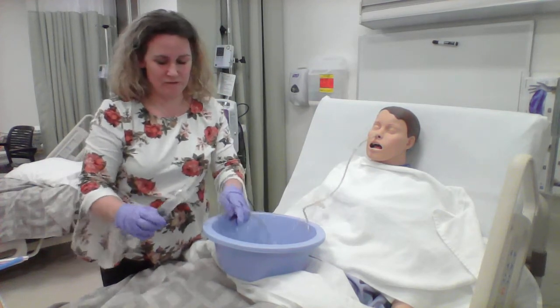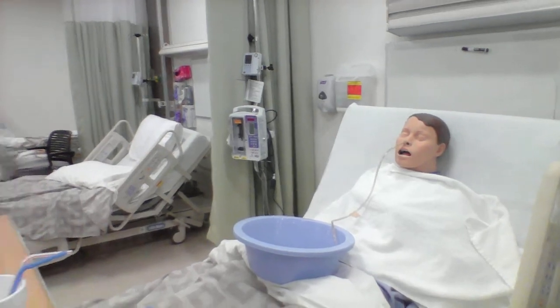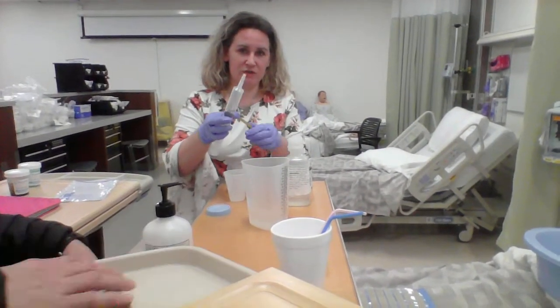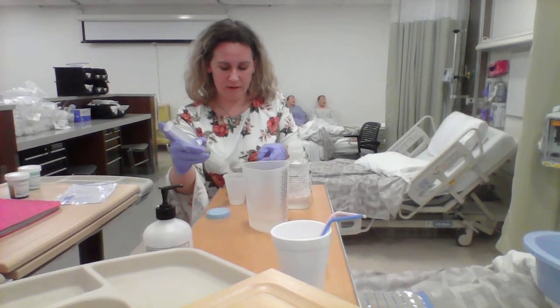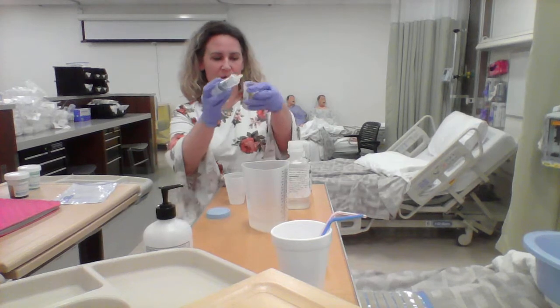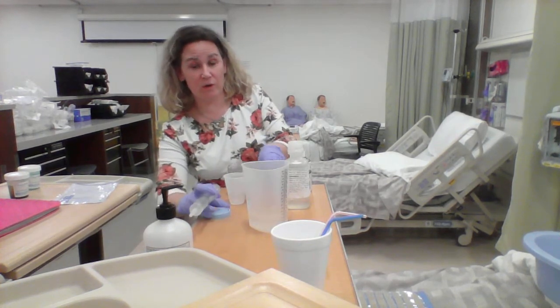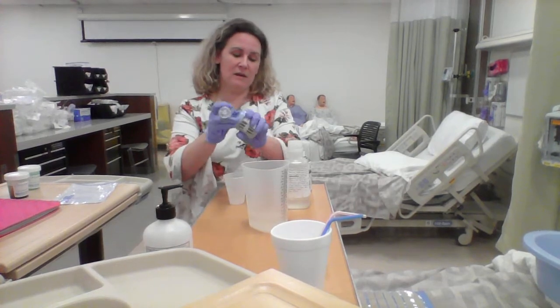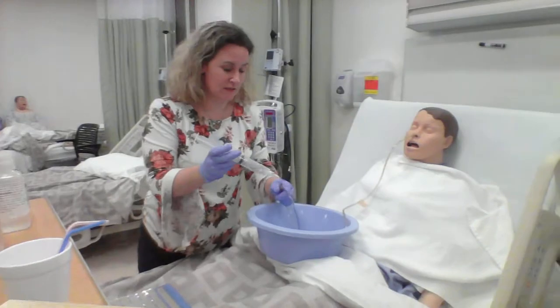I'm going to check our pH strip, see what kind of drop is on that, what's the right solution. We compare with our pH, and we see that it's below 6, so we know we're in the stomach. And then we're going to go ahead and return the gastric contents to the patient.